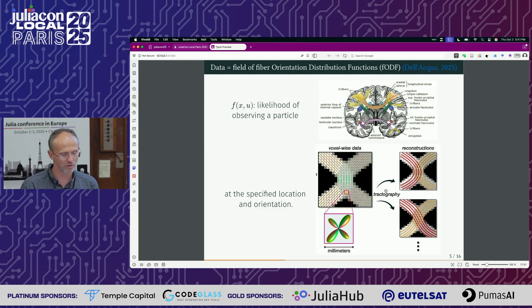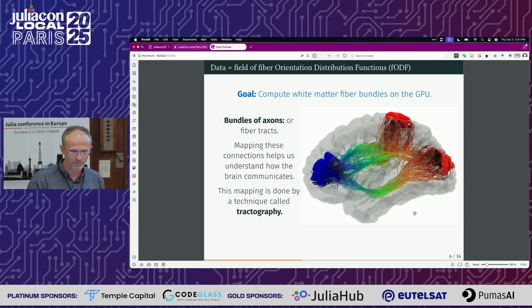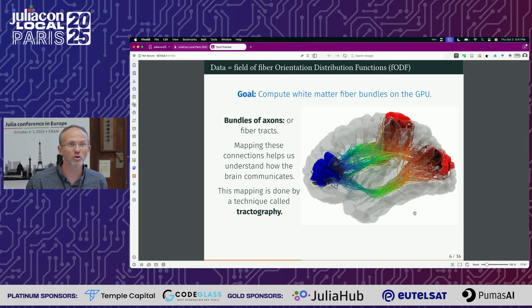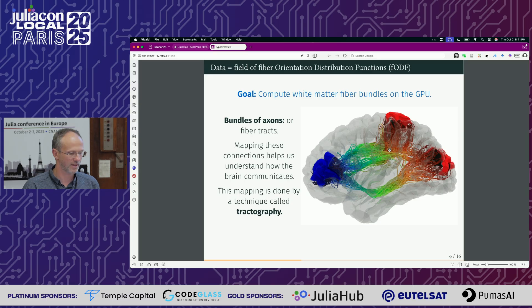In the case of a crossing, it's not easy because the crossing could yield two results — either the red one with no crossing, or you could have a crossing. The goal of this package is to compute the white matter fiber bundles on the GPU and on the CPU. Why is it important? Because it's very important to know which parts of the cortex are connected to each other. Here, for example, the reddish part is connected to the blue, and you have the tracks in between. This mapping is done through tractography.